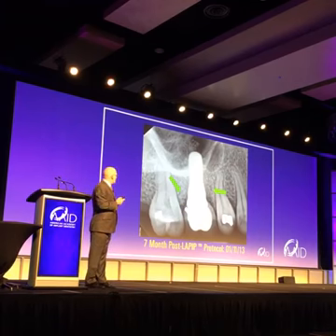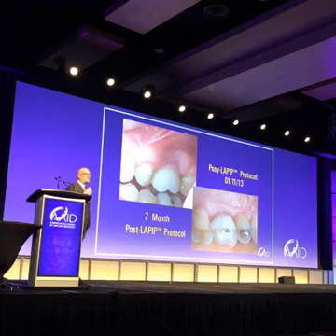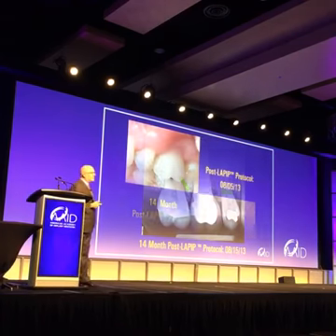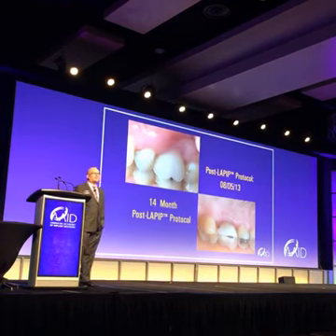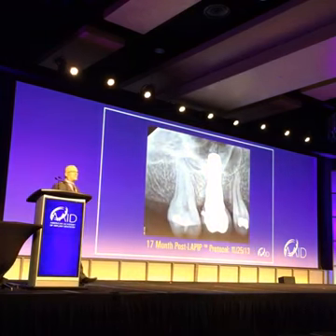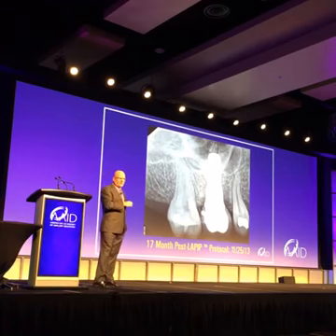Now it looks nice. But look at the tissue. Look how healthy that tissue is, it's pink, it's firm, it's not going to bleed anymore. And that's what we're looking for. That's what I want to see around an implant. 14 months later, the bone is still there. Tissue still looks beautiful. And she's not doing anything different than regular brushing, flossing, etc. And 17 months later, that bone's still there. This is a long-term solution, not a short-term fix.